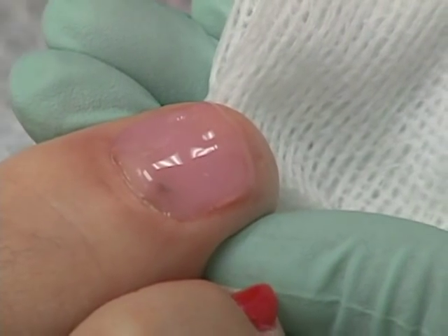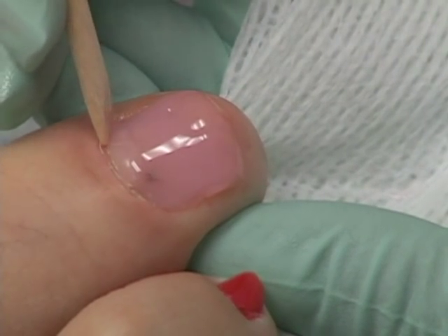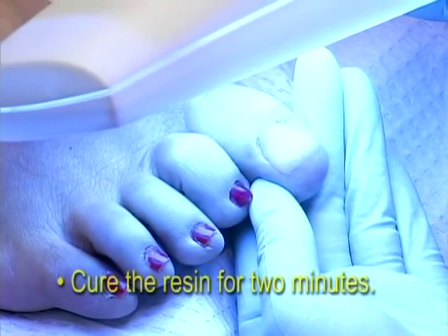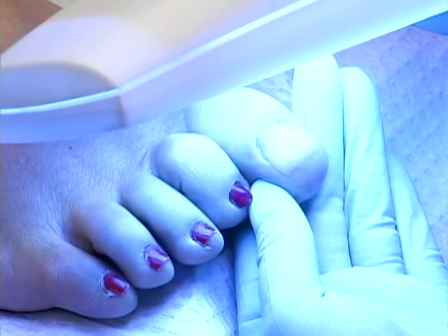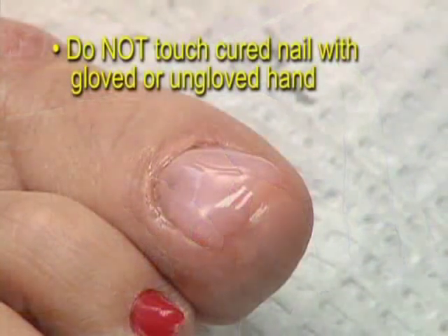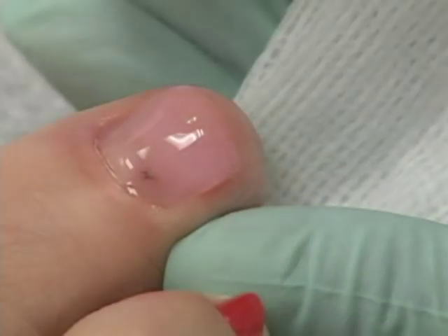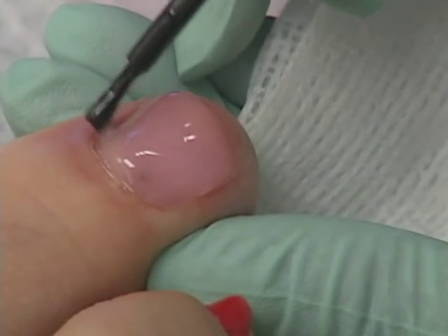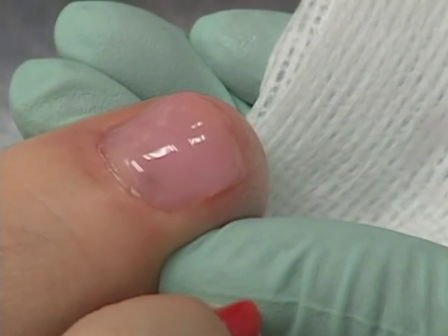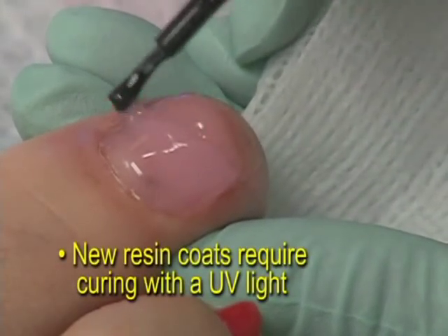When you are satisfied with the coverage and the symmetry of the resin application, it is time for the curing phase of the procedure. Position the UV light over the nail and cure the resin for 2 minutes. If a patient requires a second or third coat of the Keriflex resin after curing with the UV light, you should be sure NOT to touch the cured nail with a gloved or ungloved hand, as touching the nail at this stage may break the bond between the first Keriflex coat and the next one. If you want to add more resin, there is no need to apply Keriflex bond again; simply apply another layer of Keriflex resin on top of the cured coat. The new resin coat would require curing with the UV light.